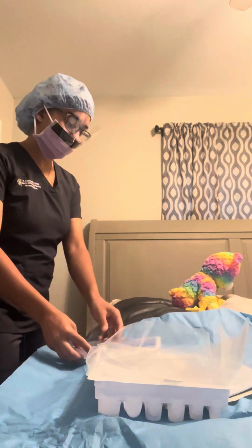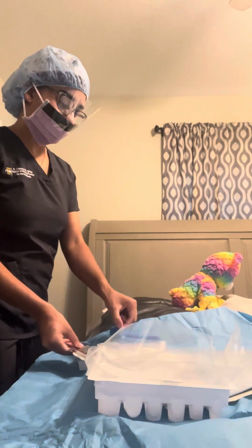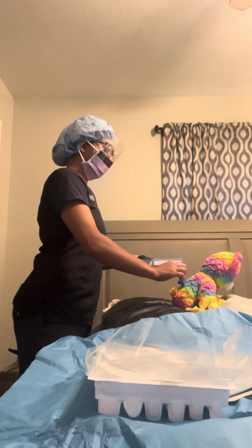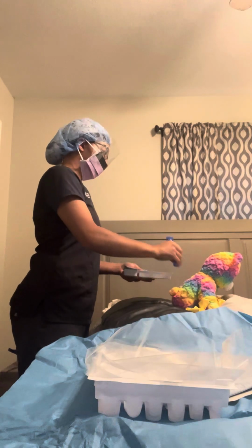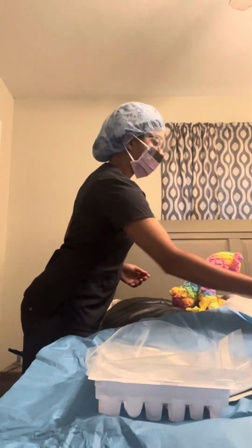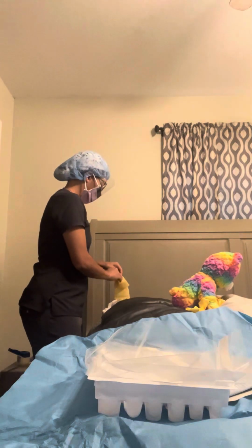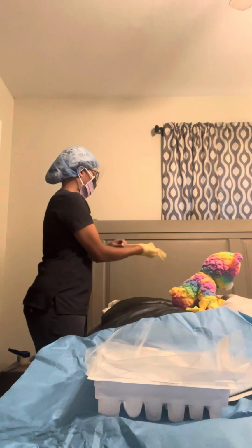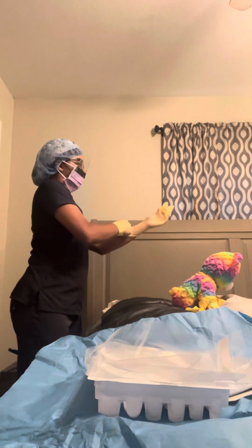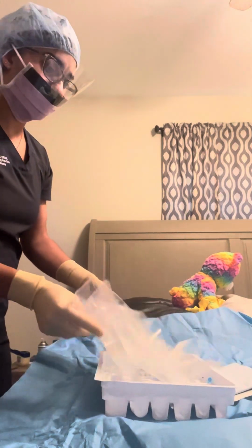And apply the cleaning solution over these swabs and clean the patient's back. Now I'm going to apply my sterile gloves. And I'm going to assemble the rest of my epidural kit.